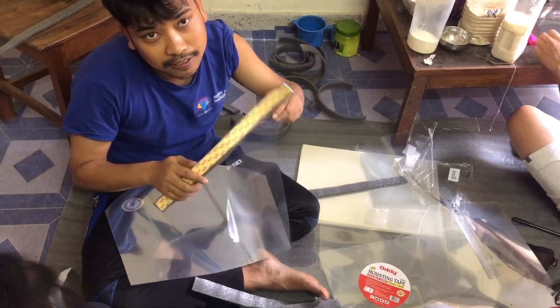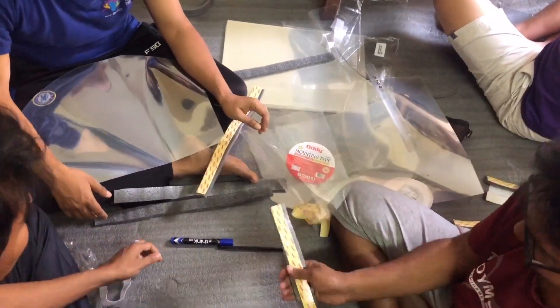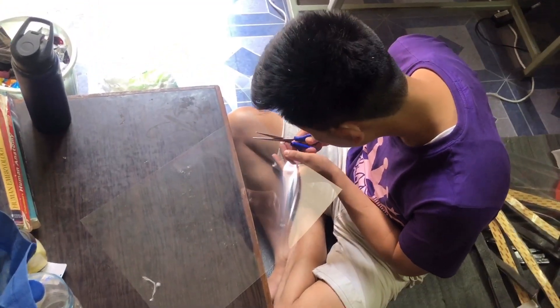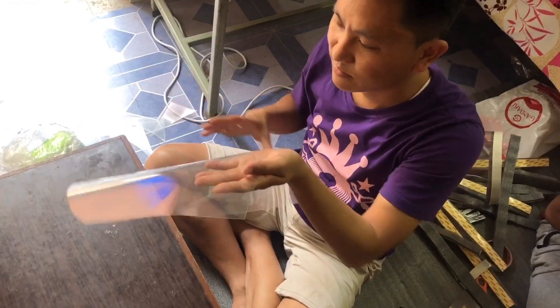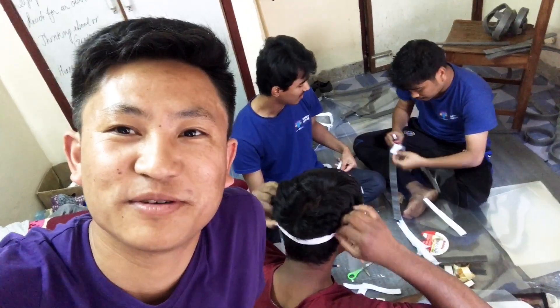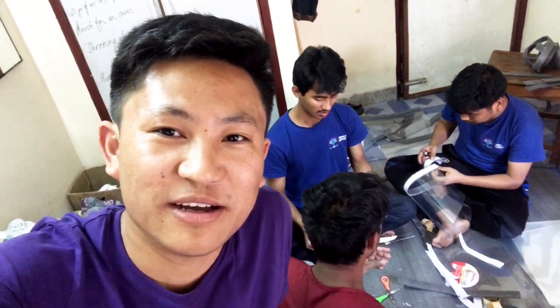Hello guys, I am making this special equipment. My name is Dr. Manoj, Dr. Rajat, Dr. Krishna, Dr. Gopal, and Dr. Anoj. We are going to make a special face shield.